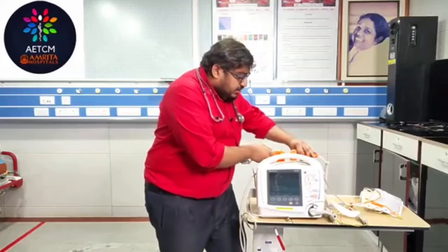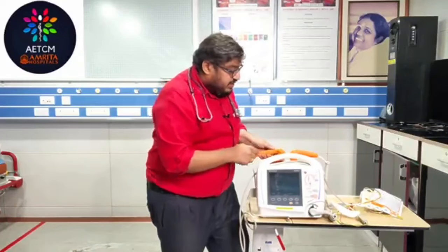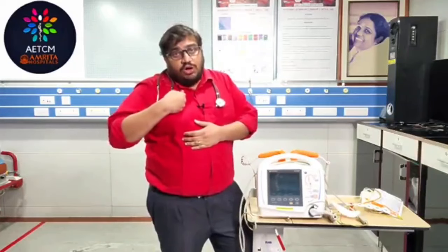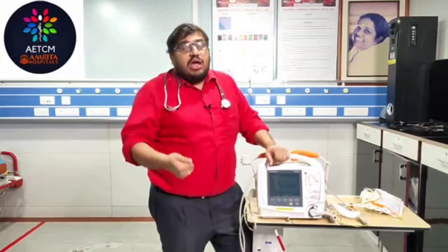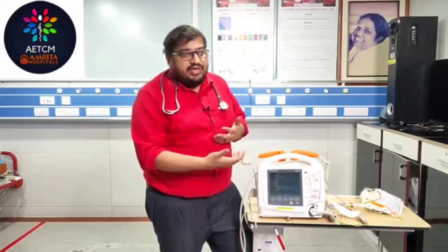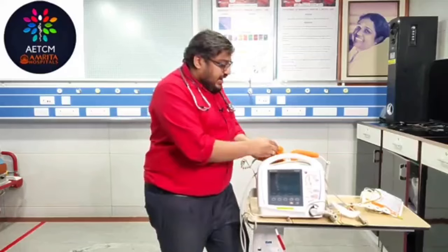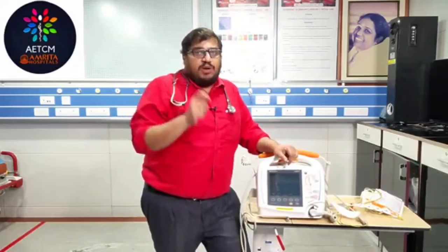And most importantly, there will be an indicator. You can see a small indicator here. This indicator will show you the contact, because if you don't have adequate contact with the chest wall, it will not deliver the shock properly. So you should have proper contact with the skin. This light should be green. There are different methods in different defibrillators. Some don't have this indicator, some have it, but this machine has this indicator. So if it is showing a green light here, that means the contact is good. Then only the shock will be delivered properly. So that is regarding your defibrillation.